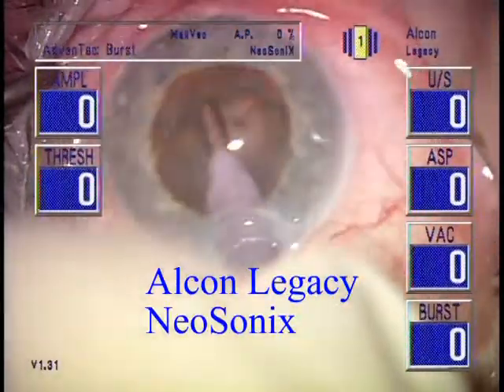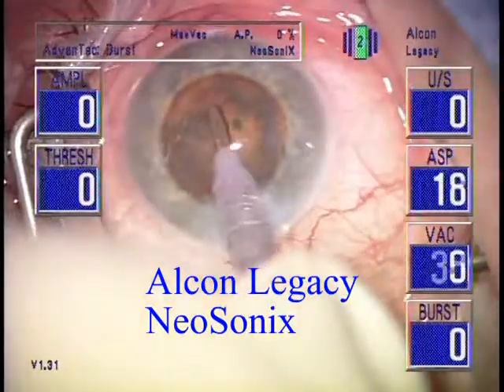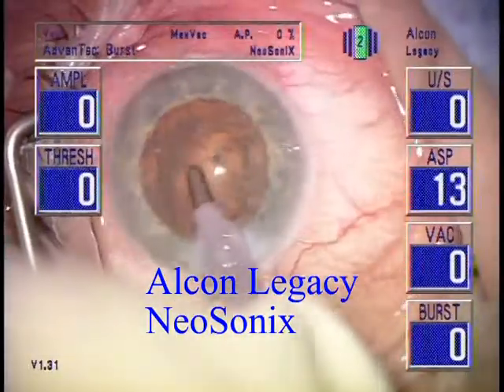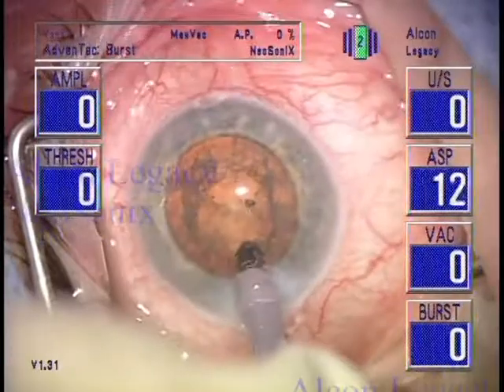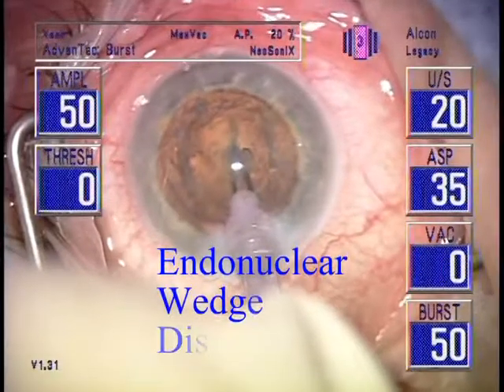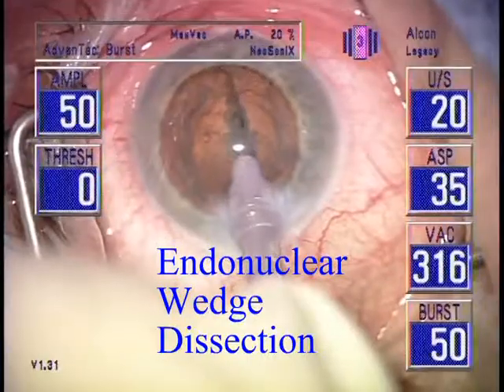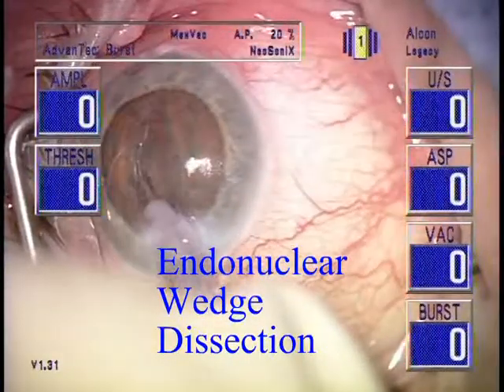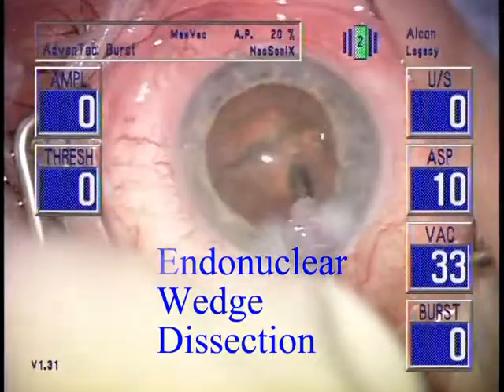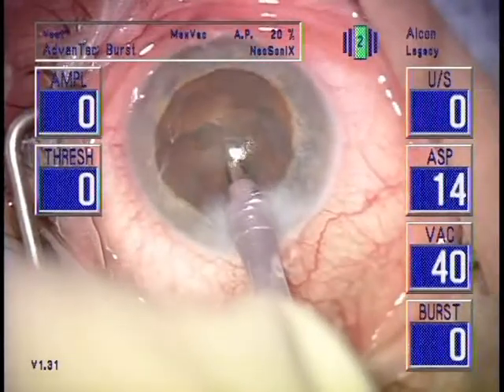The Safety Bevel Probe has a wedge-like cracking action which dissects the endonucleus in two with forward motion of the probe. This Alcon Legacy Neosonic machine has been programmed to deliver a single 50 millisecond interval of combined ultrasonic and neosonic power when traveling from foot position 2 to foot position 3. The vacuum will go up to well over 500 millimeters of mercury by allowing the peristaltic pump to run in foot position 3 without interruption.